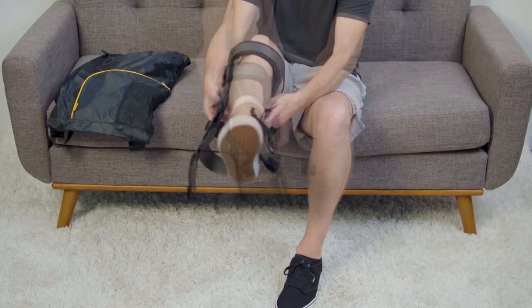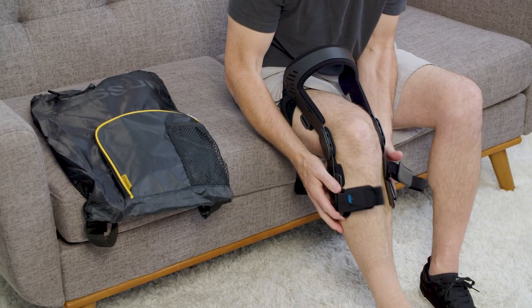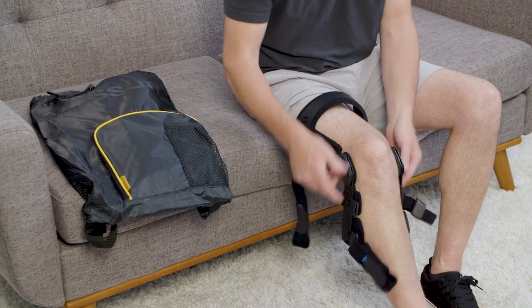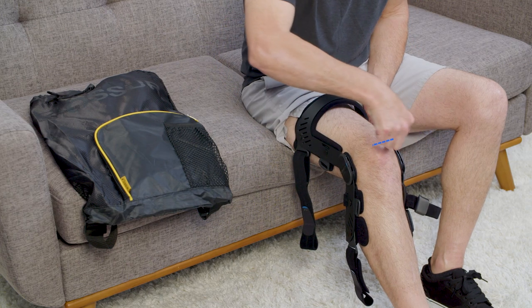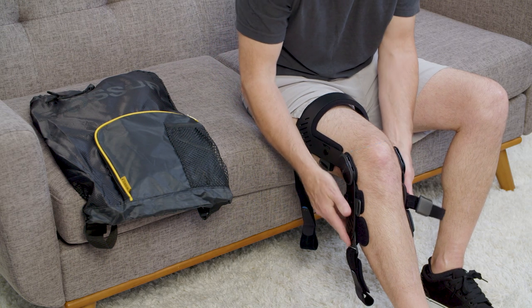Bend your knee to between 30 degrees to 45 degrees and step through the device. Slide it up on your leg such that the kneecap is centered between the condyle pads. Align the Osir Hinge Alignment Guide with the top of your kneecap.